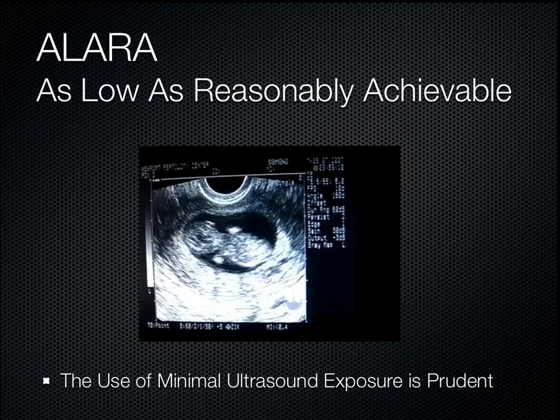But if you look at the world's literature on the bioeffects of ultrasound, there certainly are bioeffects of ultrasound. There's something called the mechanical index and the thermal index, where we know that there is energy going into the tissue, into the patient, and so we want to be aware of that and remember the ALARA principle and not use unnecessary ultrasound when we don't need to. So that's something just to be aware of. Though the world's literature has not shown any epidemiological evidence of fetal abnormalities in humans from ultrasound exposure, and that's going back over 40 years now.